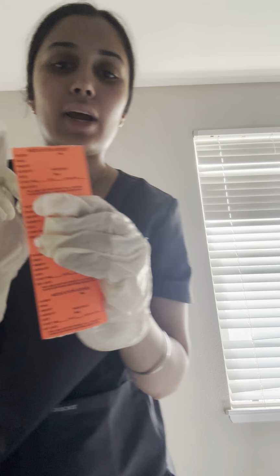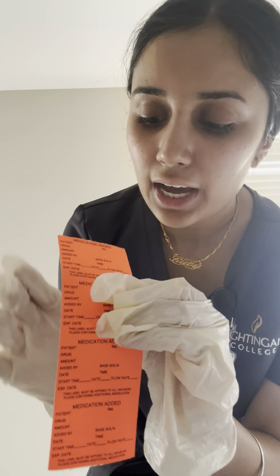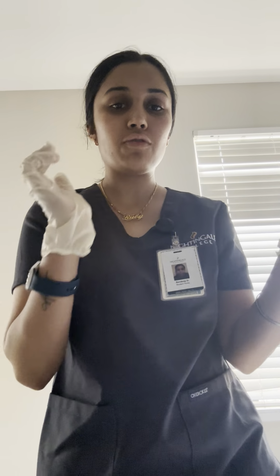And then I have my red label. This is what we will utilize at the end of the procedure. It will be placed onto the IV fluid bag, and it just lets the oncoming staff and you know when the infusion was started. Of course, it has the patient's name, the type of drug, amount, a room number, and then you would put your initials and the date and the start time as well as the expiration date of the fluid bags.